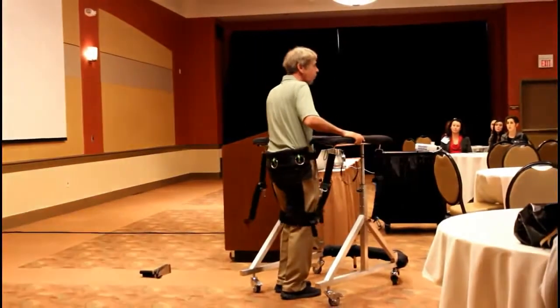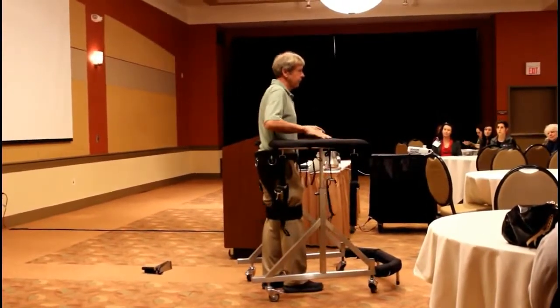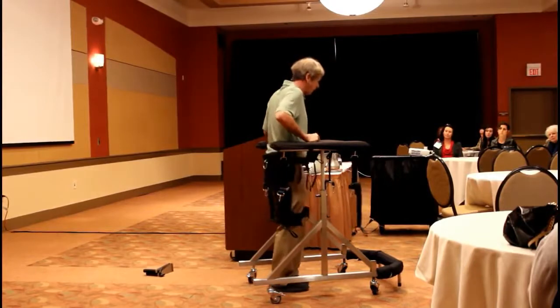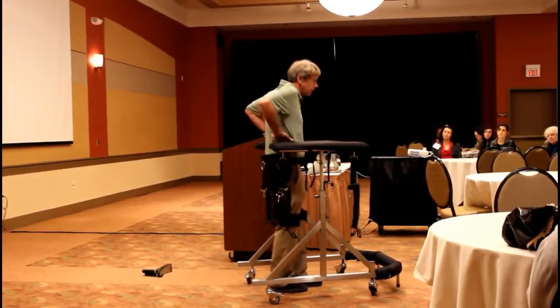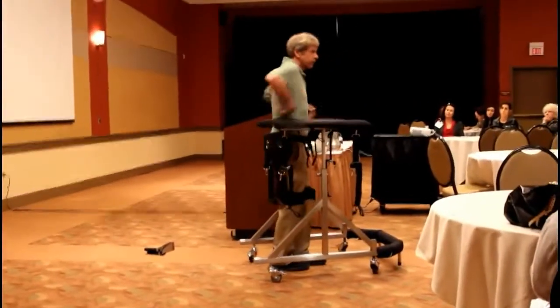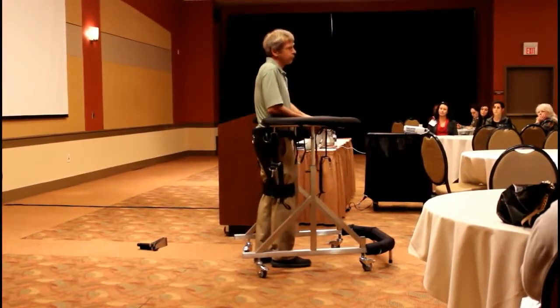Get someone who hasn't walked in 5, 10, 20 years and put them in this and start working with them. And even if you're trying to work with core strengthening, when you're initially not even able to take a step, it's allowing that person to get in and start making those connections with the brain and the muscles. Oftentimes I'll see people that haven't walked in many years, and they'll immediately slump forward because those muscles haven't been used. That's a positive thing, that you're finally making that connection and starting that process.